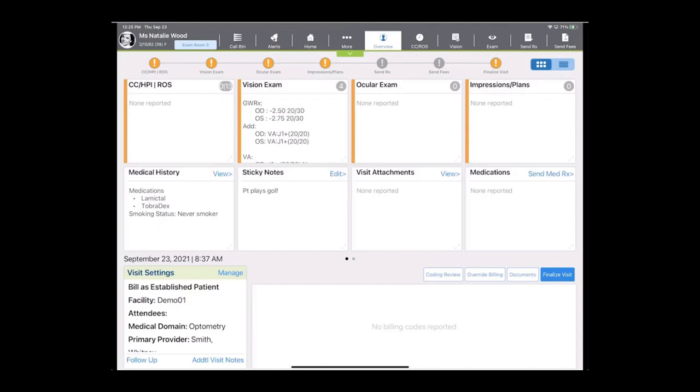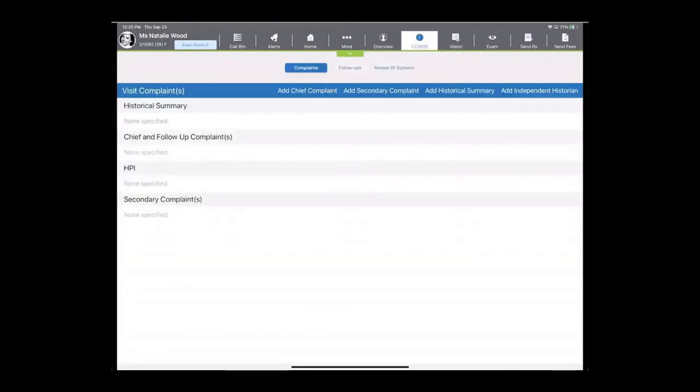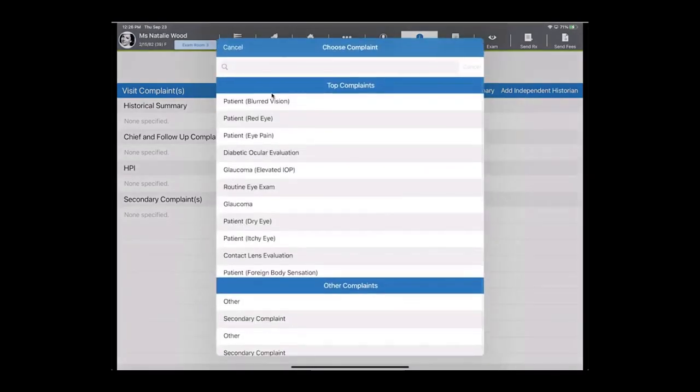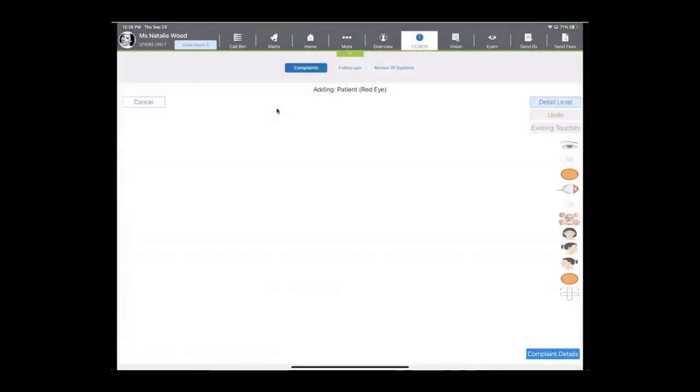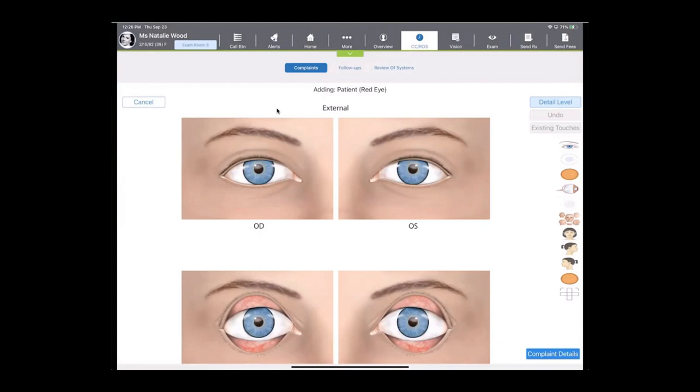First, let's hop into chief complaint, history of present illness, and review of systems. So I want to show you a chief complaint today. You may be doing this, or your technician may be, but it's pretty simple. We're just going to add a chief complaint, and then a list is going to populate that's custom to our practice. So these are the top complaints that we see here in our environment. So today, the patient's come in, we're going to see them for a red eye.